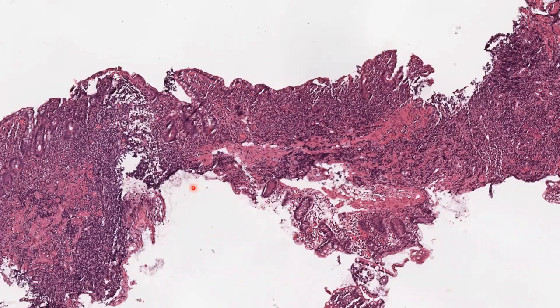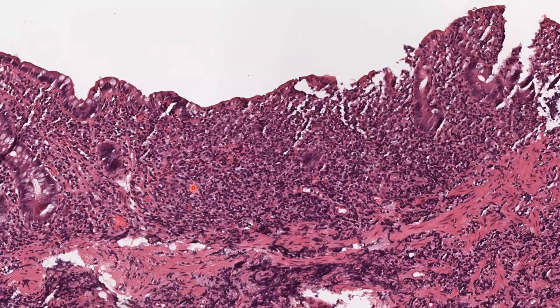One thing to remember with this as well is that ulceration, as you are able to spot on the left-hand side of this biopsy, can happen. You can lose the surface epithelium here with the chronic inflammation, right? So it is still part of the equation that it can happen, and then you start to get regenerative features.